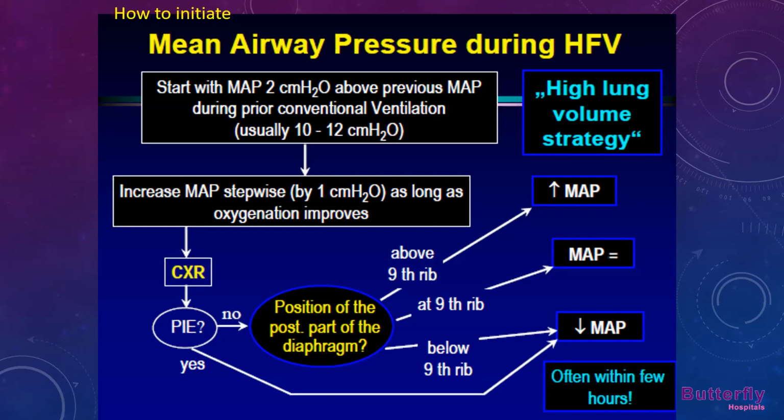As we have seen so far, I'm discussing the mean airway pressure. It directly influences only the oxygenation. It doesn't have much effect on the carbon dioxide clearance, the ventilation.